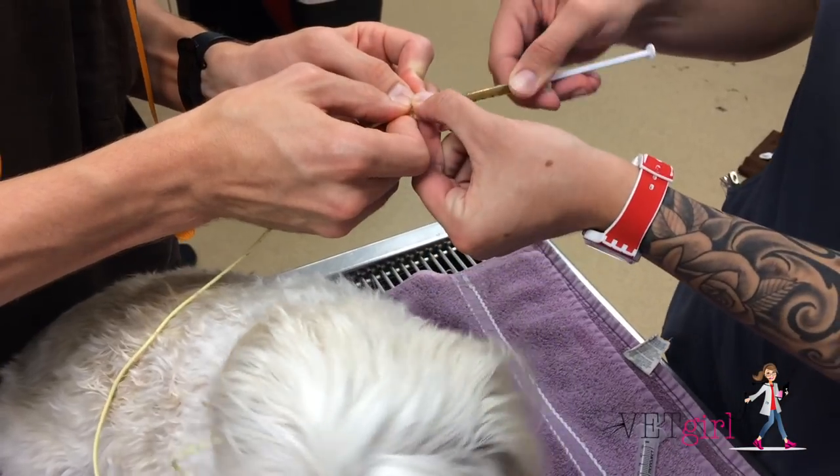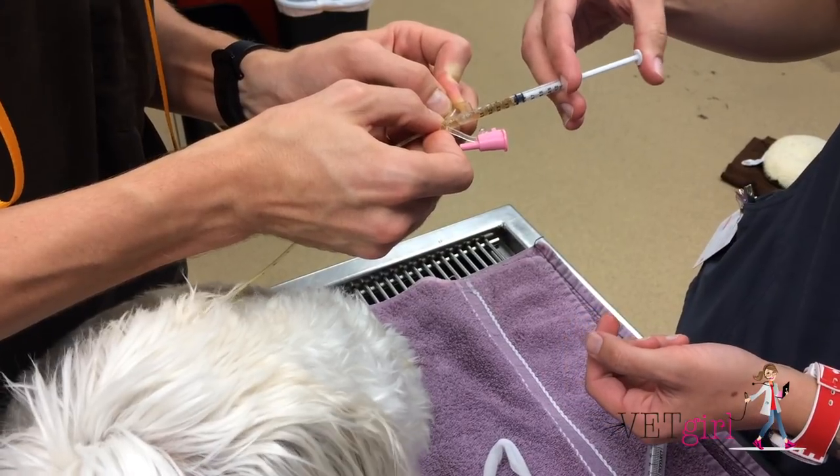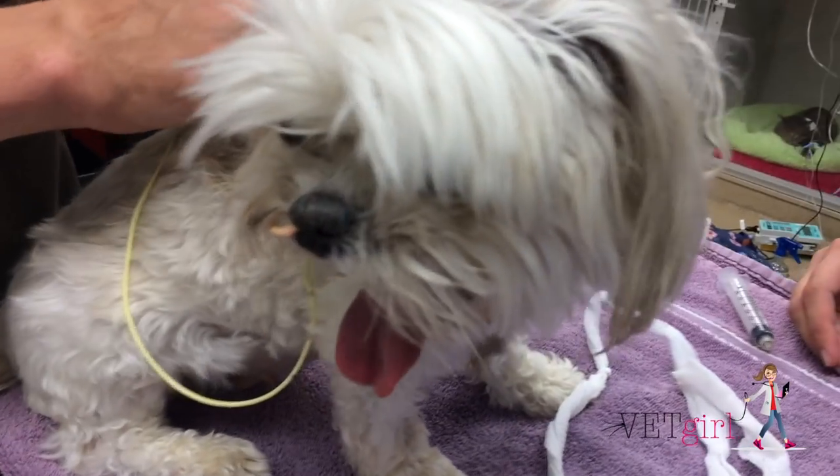Simply flush the soda into the feeding tube, let it sit for a minute or two, and then flush with water. This is a very simple technique you can teach pet owners to do to manage clogged feeding tubes at home too.